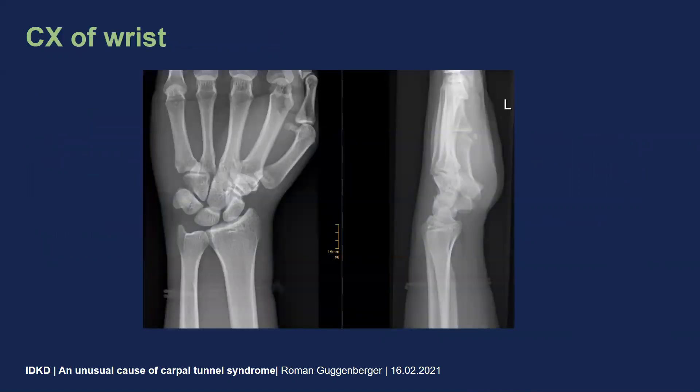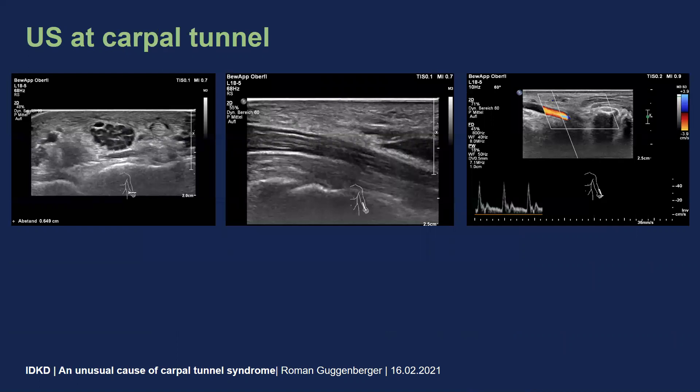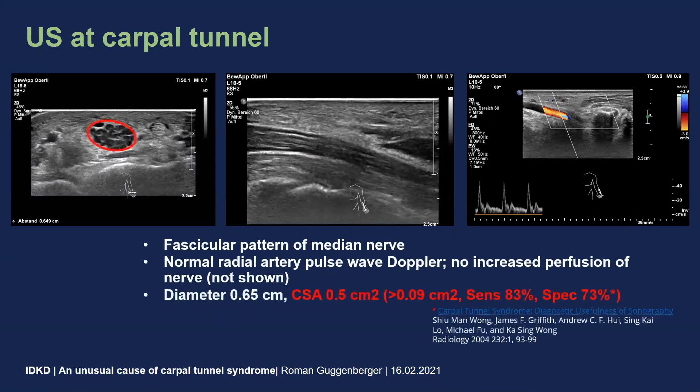The conventional x-ray of the wrist was actually unremarkable. We could not find any signs of trauma or fracture. At the ultrasound, our resident found a significantly enlarged median nerve underneath the flexor retinoculum with fascicular structure of the nerve, and on Doppler ultrasound there were normal pulsations in the radial and ulnar arteries. However, there was no increased perfusion of the soft tissues or the median nerve itself. The diameter of the nerve was significantly increased to about seven millimeters, and especially the cross-sectional area was about half a centimeter squared, which would be highly indicative of a carpal tunnel syndrome according to many publications in the literature.